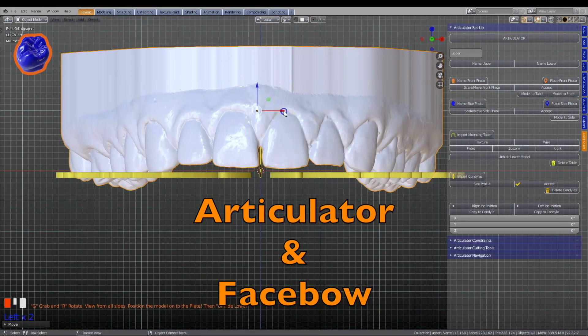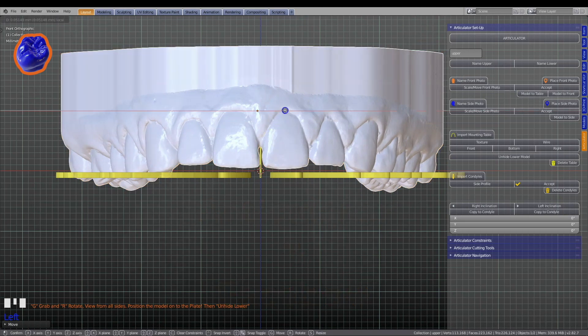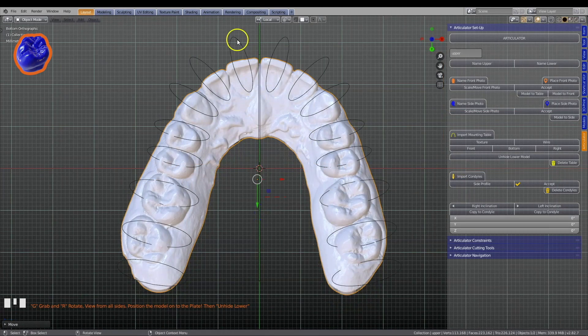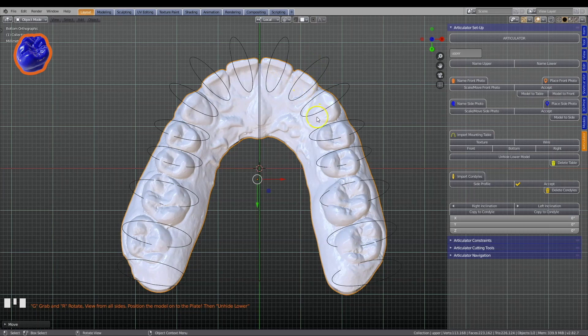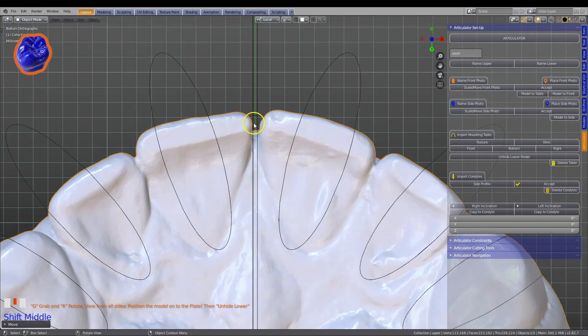Blender for Dental is powered by the open source Blender software program with add-ons designed to take your digital dental experience to a whole new level.